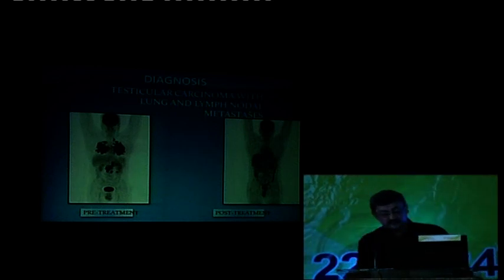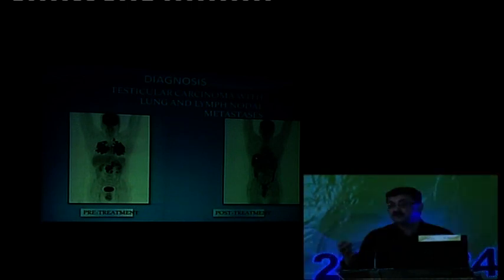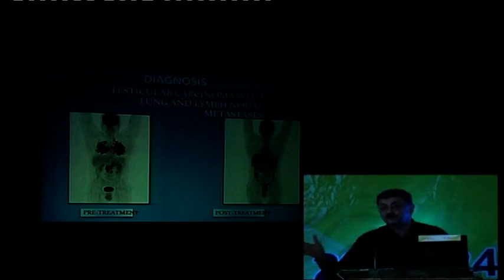And when the treatment was given, you can see post-treatment, all these lesions have just vanished. So you have a powerful tool to diagnose malignancy, to see where it is, even with an unknown primary. You can diagnose infection, you can diagnose sarcoidosis, and you can follow up.